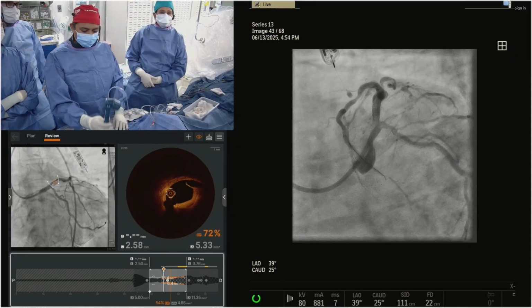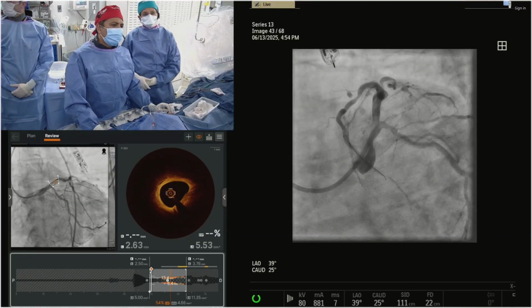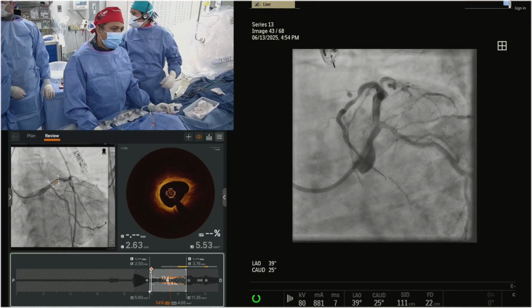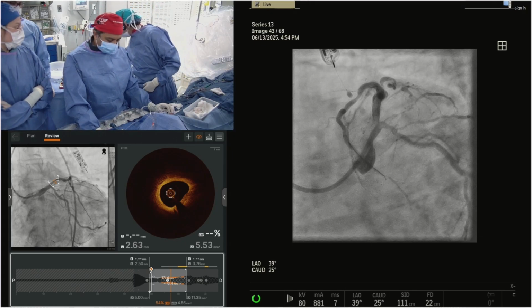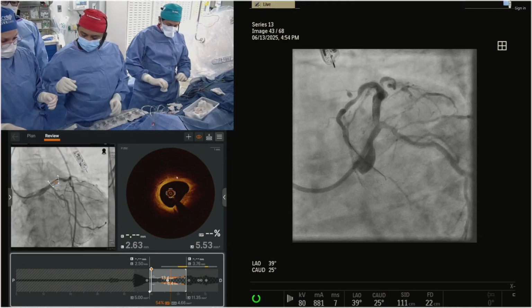Just remember, this is how to do angiography, though. Looking for calcium, you start with cine, then give dye, and then you can see the different shadows. Do you need another OCT? Let's see, can we show, how many votes does he want for another OCT? How many will do OCT again? Give me a plus from the podium. None. No.